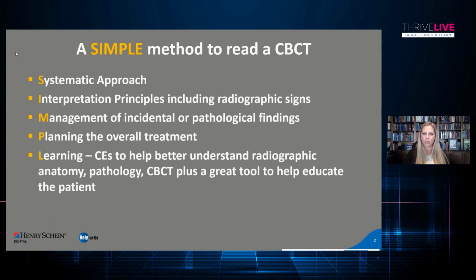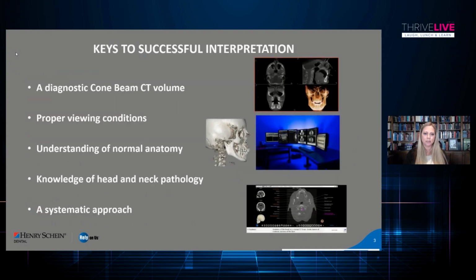And learning. We always want to keep learning. I think anytime there's any new technology out there, we want to take additional courses to be able to better understand what it is that we're looking at, particularly radiographic anatomy and pathologies. We also know that cone beam CT is a fantastic educational tool for our patients as well. And finally, we want to discuss ethical and legal considerations, what you need to know as the dentist.